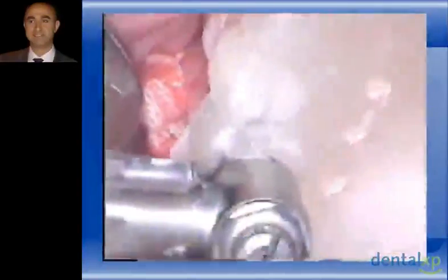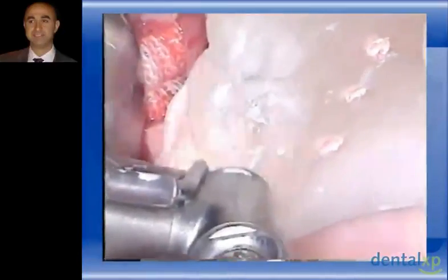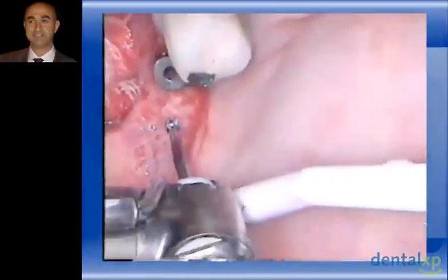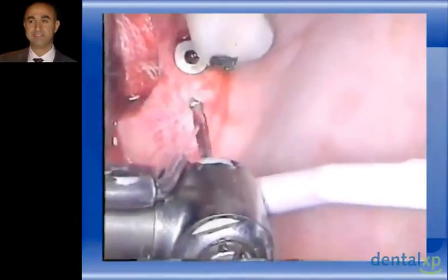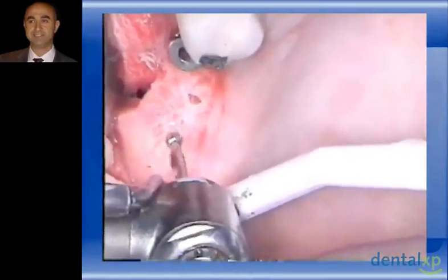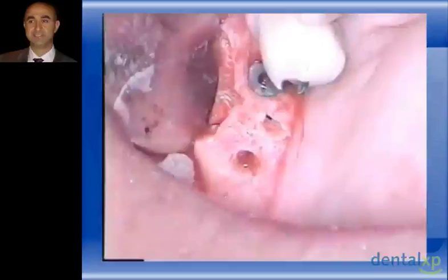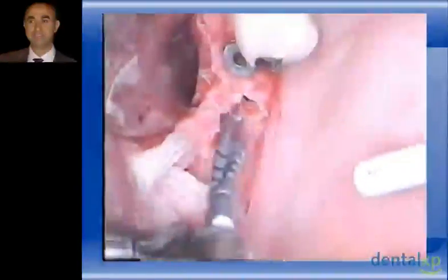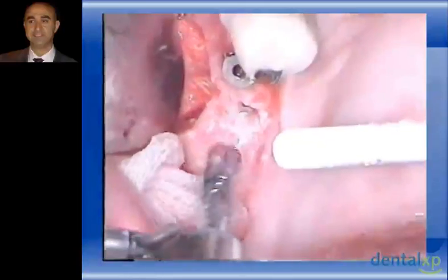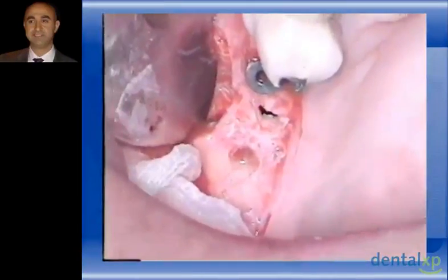Using the surgical guide to exactly place my implants, I had placed 1 implant before, which is integrated. Now I'm placing the other 2 implants, which are going to be splinted together, keeping in mind the tripoding of these implants according to the waxed-up cast from which the surgical guide was fabricated. If you look at these osteotomy sites in relation to the first implant and connect them together, they are tripoded.